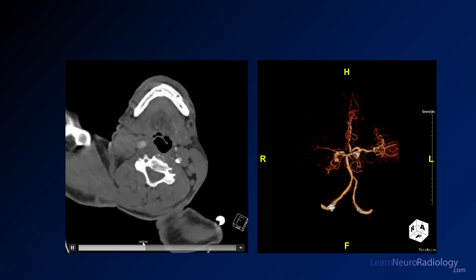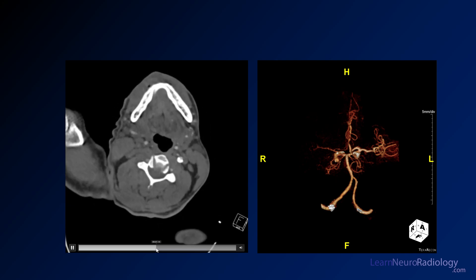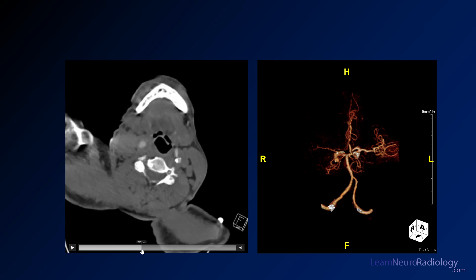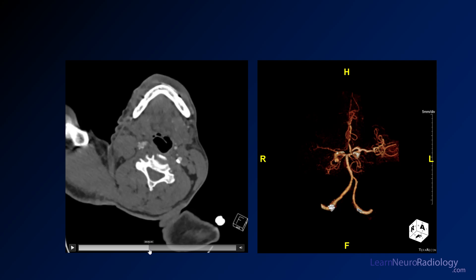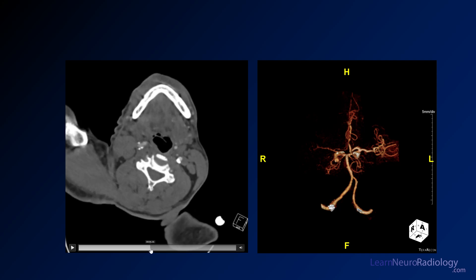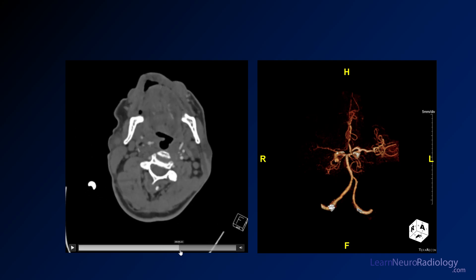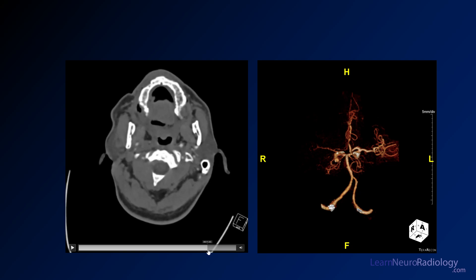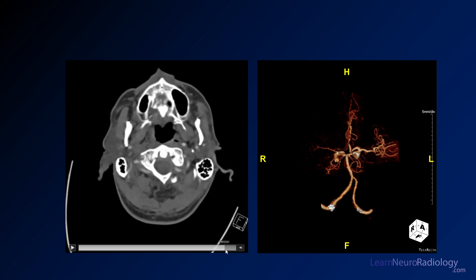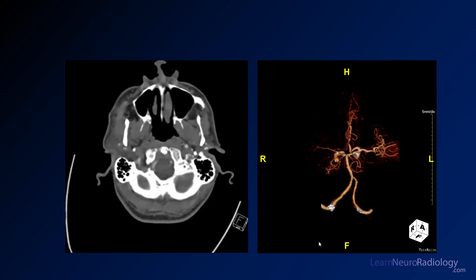We get to this right carotid, and you can see at the carotid bifurcation we're going to bifurcate into the external carotid and internal carotid — and we kind of lose the internal carotid there. So as we come up, that internal carotid artery is occluded in the neck.